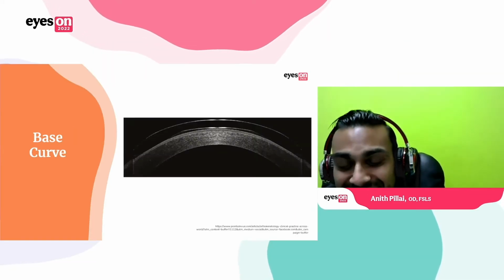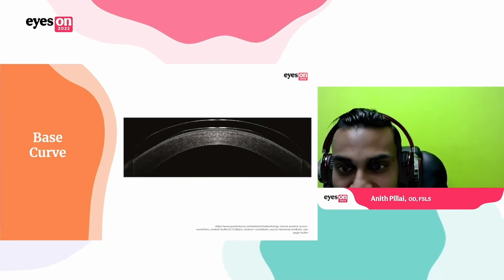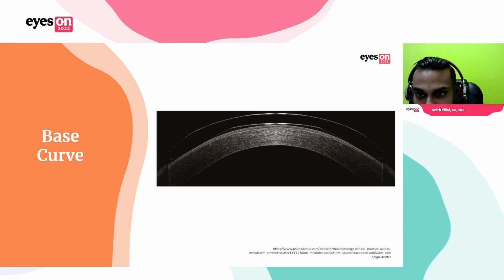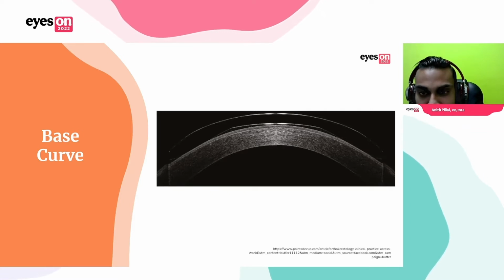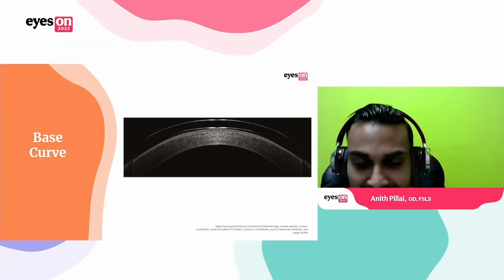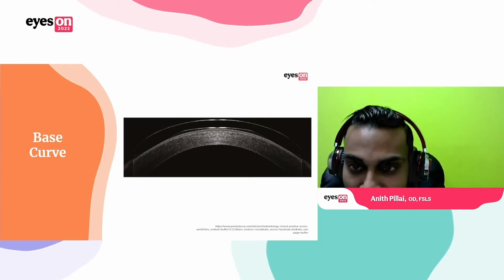And if you don't believe me, here's an OCT image of it. This is an anterior segment OCT image of an Ortho-K design on top of a cornea. You see centrally, there is no touch. There is a thin layer of clearance there, and that's exactly what we want. And in that mid-periphery, it steepens up to cause that negative pull force, but that positive push force centrally is not due to mechanical compression. It's due to those hydraulic changes we're creating by the reservoir system.